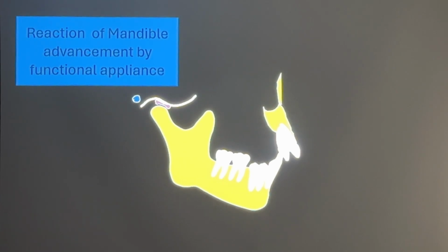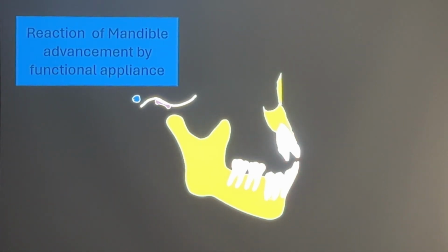We need to try to get more alveolar bone growth in this area.